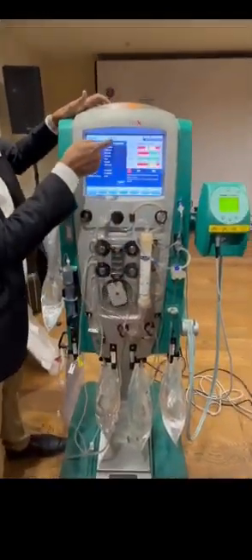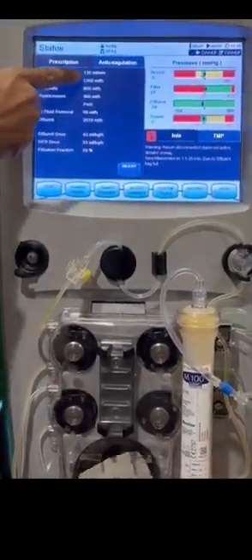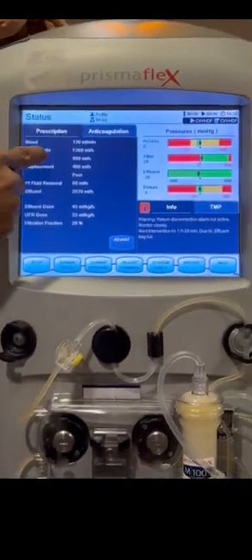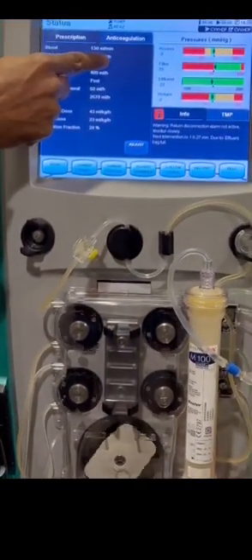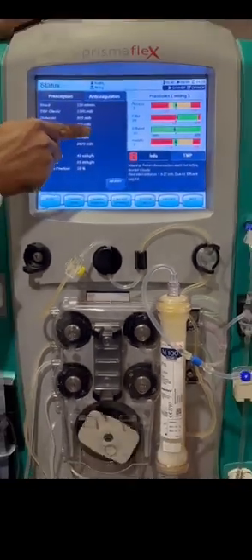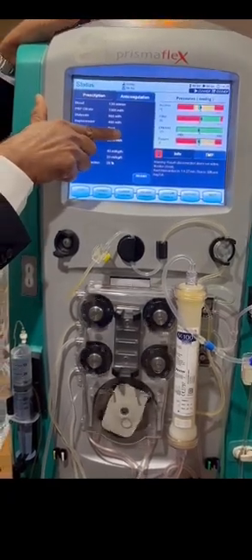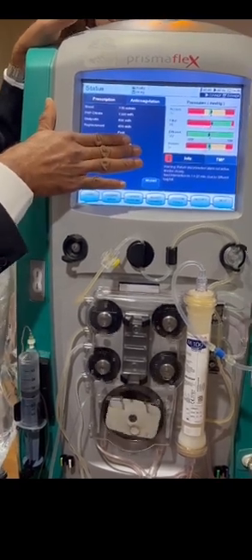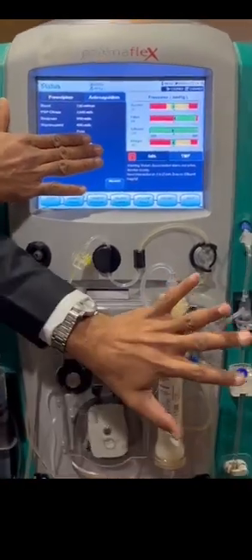Now we have the prescription window. In the prescription, blood flow is 130 ml per minute. PBP citrate, that is the flow of this solution, is 1300 ml per hour. The dialysate is 800 ml per hour and replacement is 400 ml per hour. So how much in total till now? 2100 plus 400, so 2500 ml of solution is in the circuit in an hour.